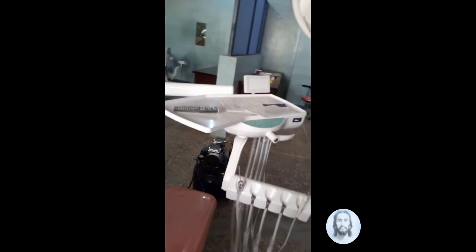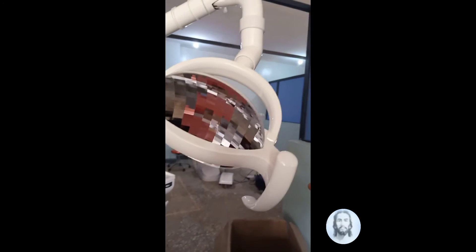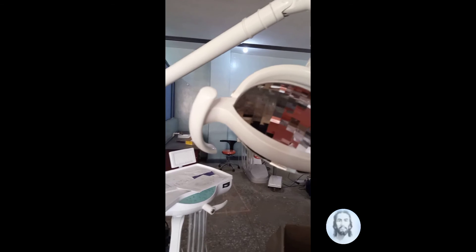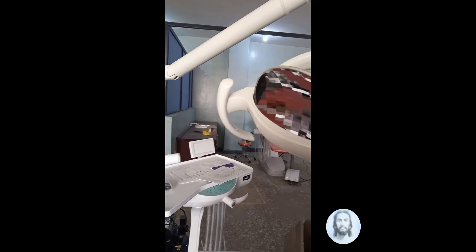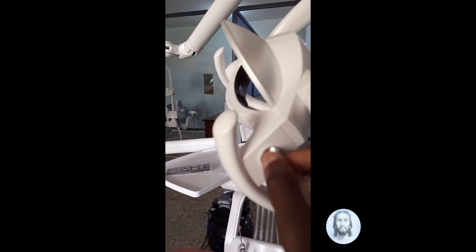Here is the dental light — this is the dental light for the dentist to visualize what has been done, with an on and control switch.